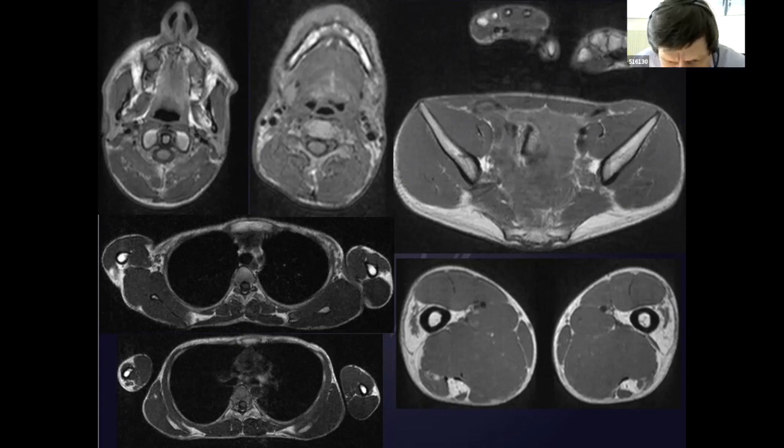We can also perform T2 mapping, which is important in dystrophic changes. For example, in Duchenne dystrophy, to detect the increase or the decrease under treatment of the water content of the muscle, and it's now used for clinical trials.